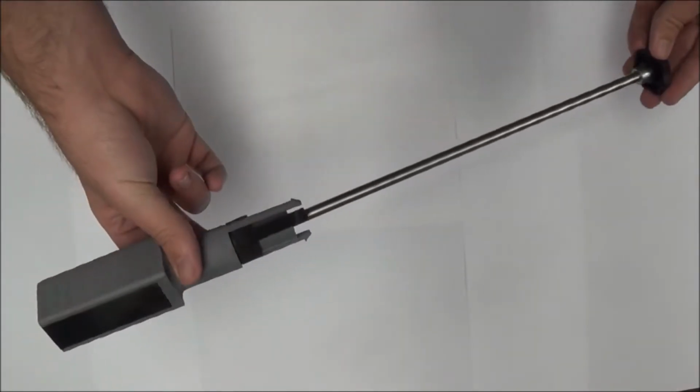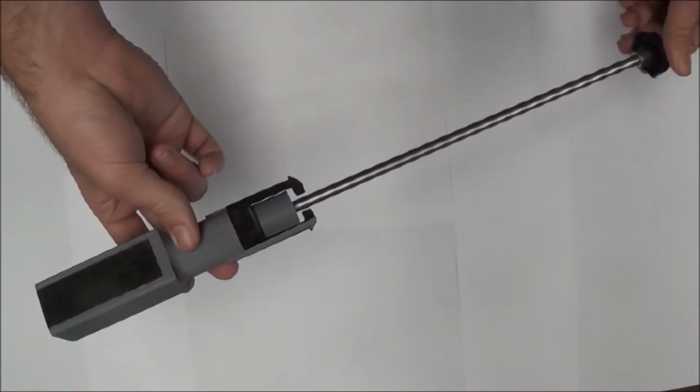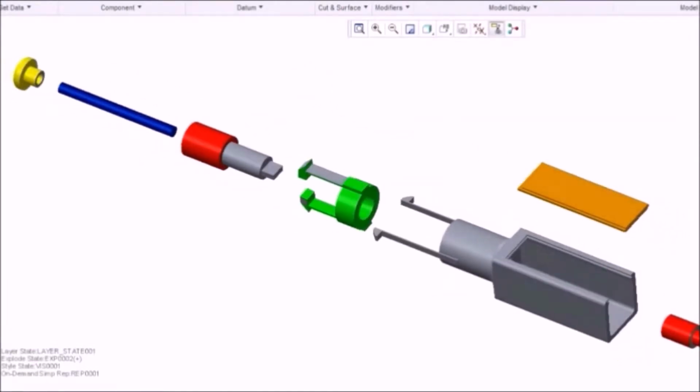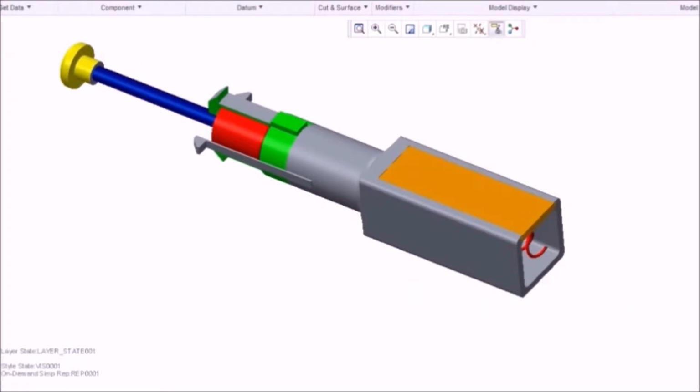The device would answer a problem that we have in endoscopic neurosurgery that to this point we do not have a good answer for. This is our device, a prototype, 30 times scale of the final implementation. Our device is a hemostatic film dispenser and isolation chamber. It is composed of a handle that, when actuated, will rotate a coil that has hemostatic films stored between the turns. This will push the films forward by a bending motion.